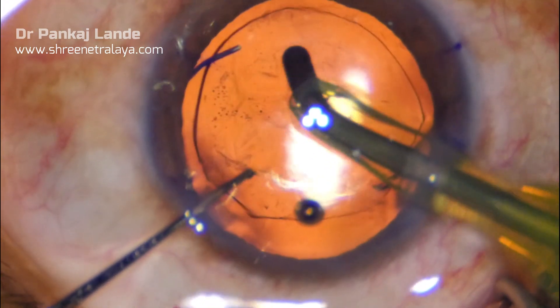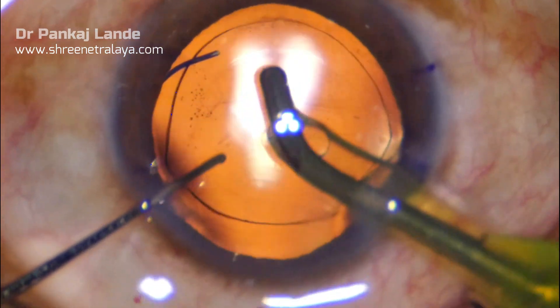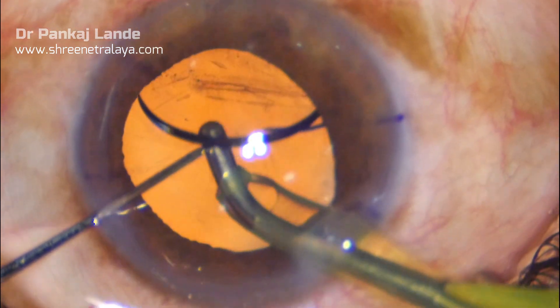Viscoelastic is washed out with settings of vacuum 500 and flow rate of 50. You can tilt the IOL and wash the viscoelastic there too.